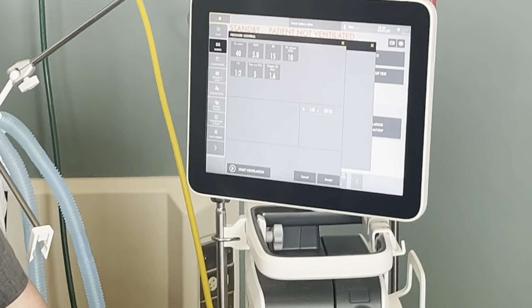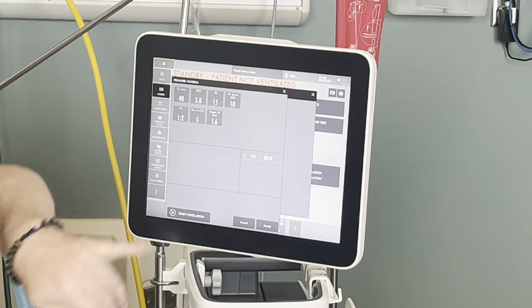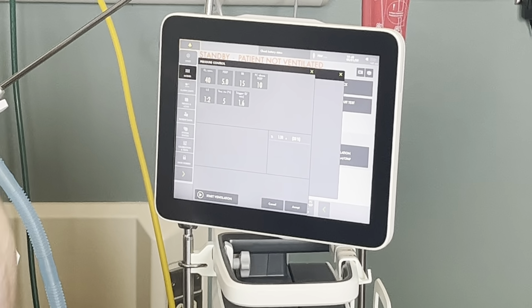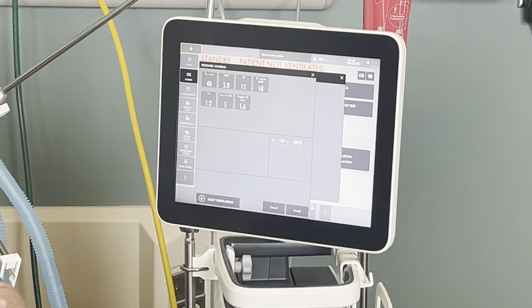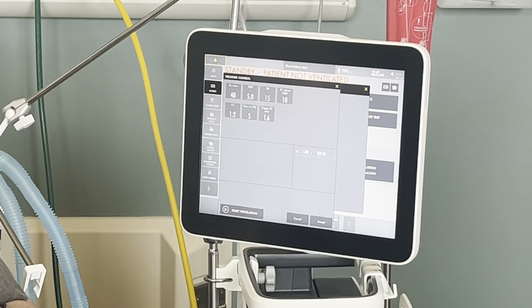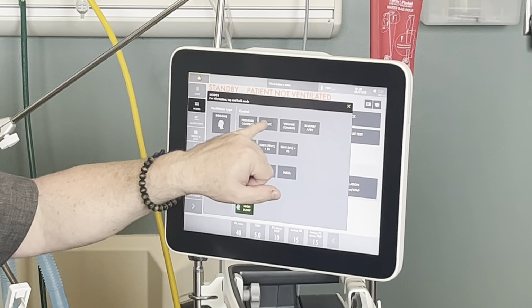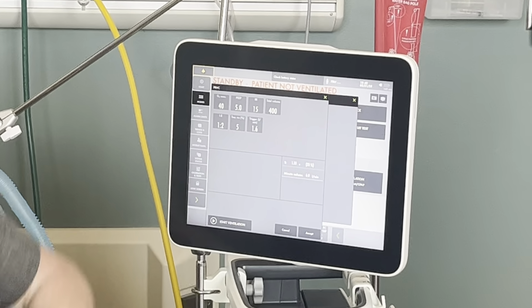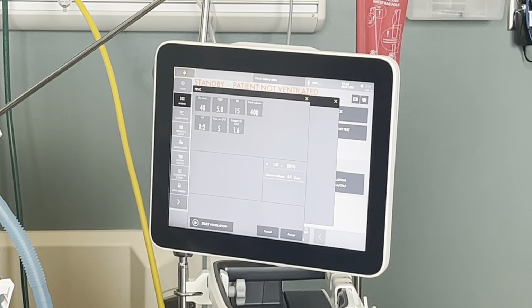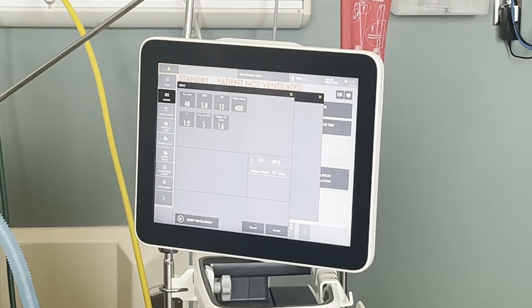Any questions on that? Okay. So the difference between this one is I set the pressures and I go up there and I kind of say, okay, these are the tidal volumes I'm looking for. Just like you do on the BiPAP, you kind of adjust the IPAP, looking for those tidal volumes that you're looking for, 6, 7, 8 mLs per kg, right? And then you come over to PRVC. So PRVC, exact same thing. So I'll ask you, is PRVC a pressure mode or a volume mode?